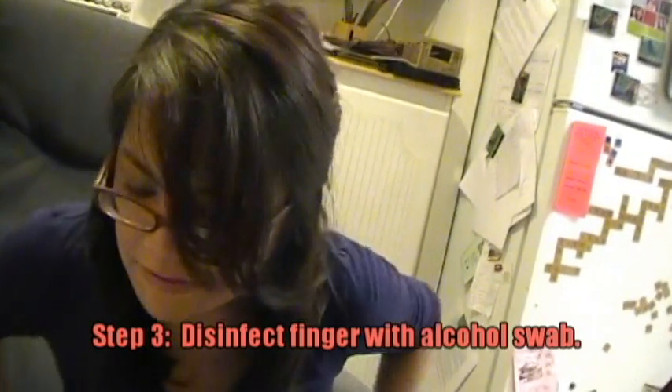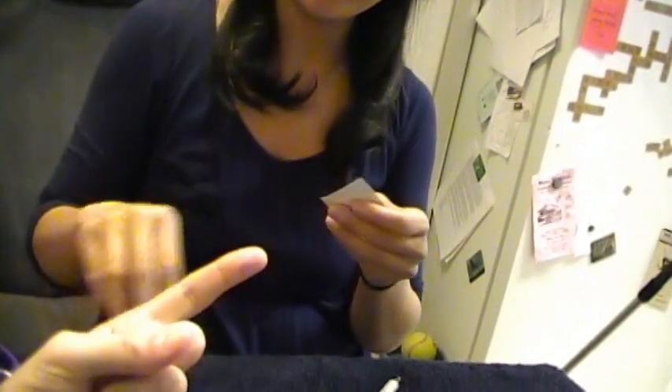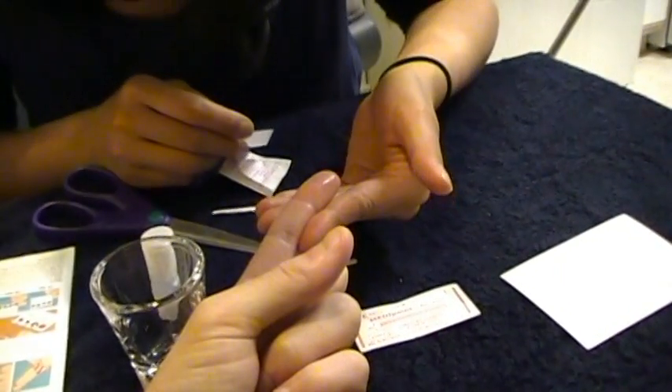Step three, disinfect a finger with the cleaning swab and let the finger dry. You want me to do your finger? I really didn't sign up for this. Okay, so I disinfected it.